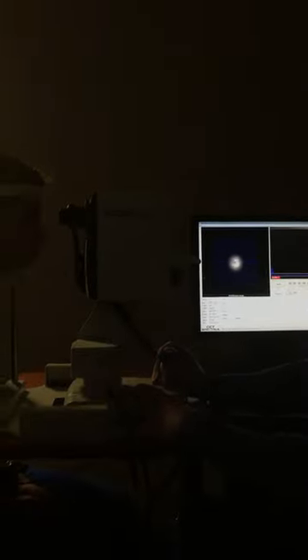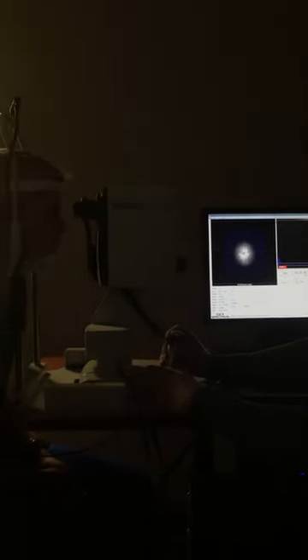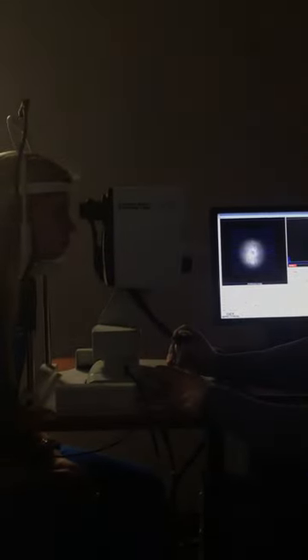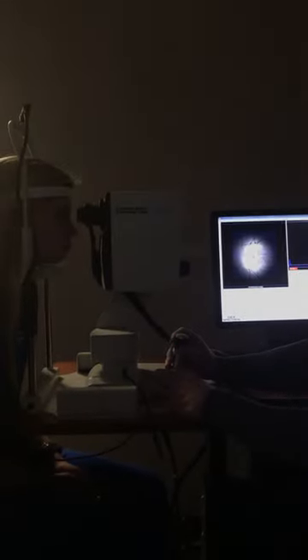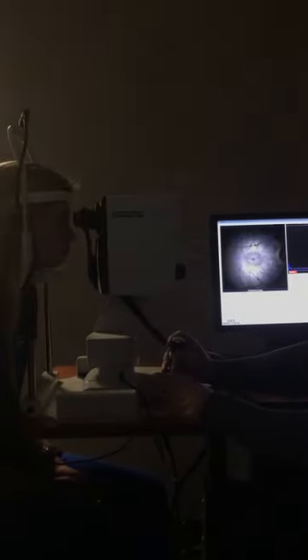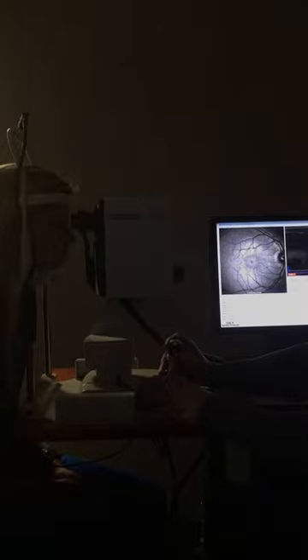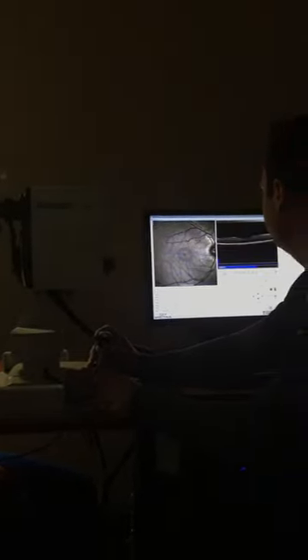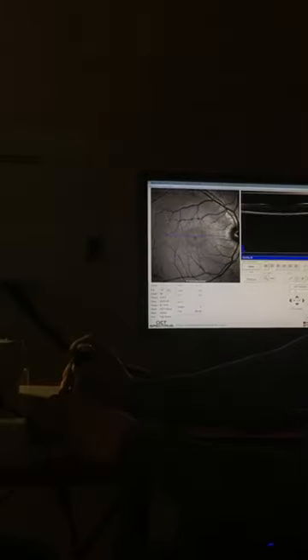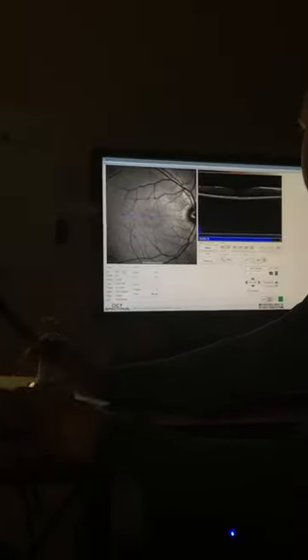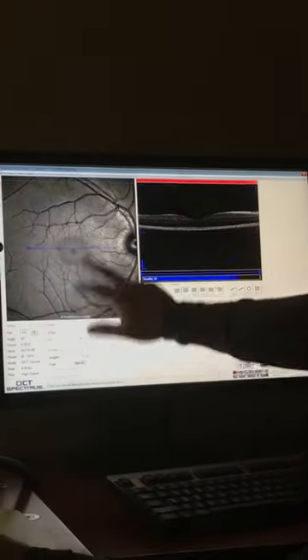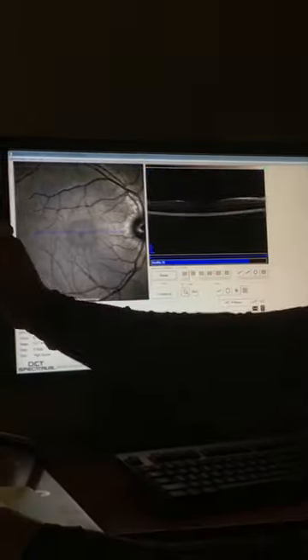We're going to line up that little white circle in the center. That's where her pupil is, and we'll go in towards that. Eventually we'll get a scan on the right-hand side. You want that scan to be in that blue box, and then we'll focus on her actual retinas and vessels.